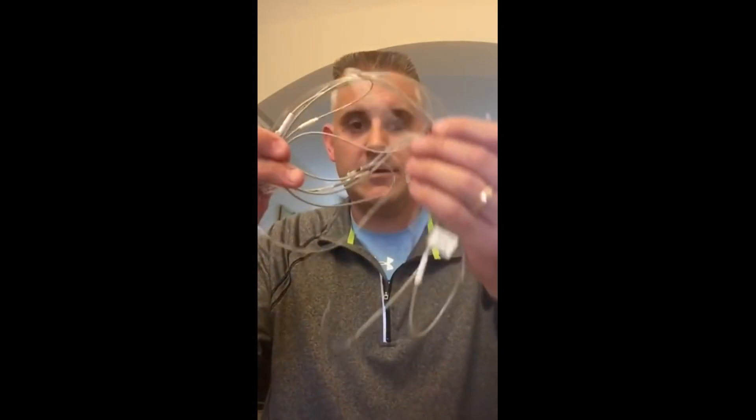Hey everybody, this is Doug. This is my second video of the day — this one's about leads. If you didn't get a chance to see the first video about devices, go check that out. It talks about the different kinds of cardiac devices, but now I'm going to talk about leads. I have kind of a rat's nest of leads that I've borrowed from a contact at Medtronic. I'll tell you about the different kinds of leads, how they're implanted, and why it's important that we take it easy after an initial implant so that we don't dislodge any leads.